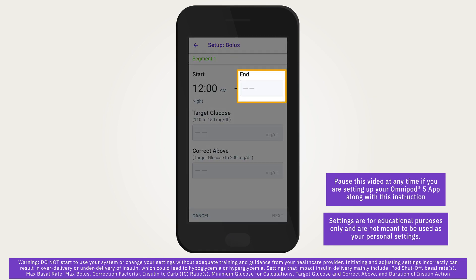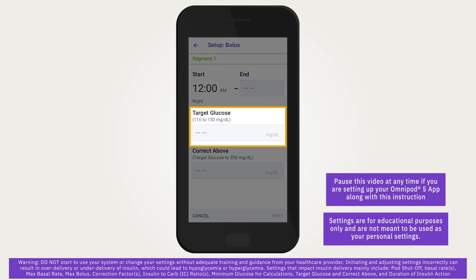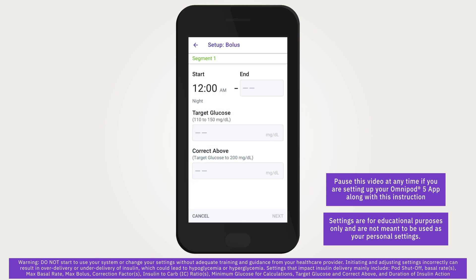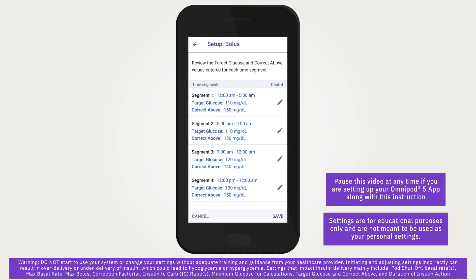In automated mode, basal insulin delivery will be adjusted automatically towards your target glucose value. In both automated and manual modes, target glucose and correct above values are used for bolus calculations. Tap next to continue, then tap the end time to choose an end time for the segment. Tap the target glucose field to specify the target glucose, and tap the correct above field to specify the correct above value for that segment. Review and tap next. Repeat until all 24 hours are complete — you can create up to eight segments. Once everything is confirmed correct, tap save.